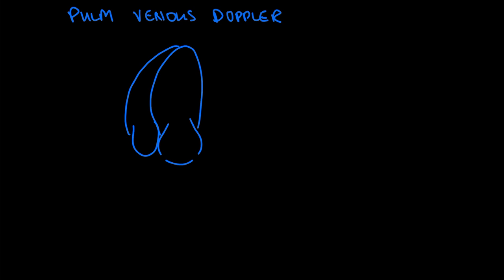Blood flows in the pulmonic veins. During systole, it fills up the left atrium, and then during diastole, it continues to flow into the left atrium, and it'll pass right through, all the way into the left ventricle. During the atrial kick, you may see a little bit of blood flow that bounces back.